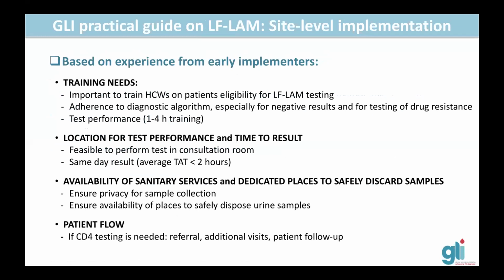Also, the guide reviews the results of the experience of early implementation by some key implementers in terms of training needs, location for test performance, availability of practical considerations such as sanitary services, and also patient flow in case CD4 testing is also required.